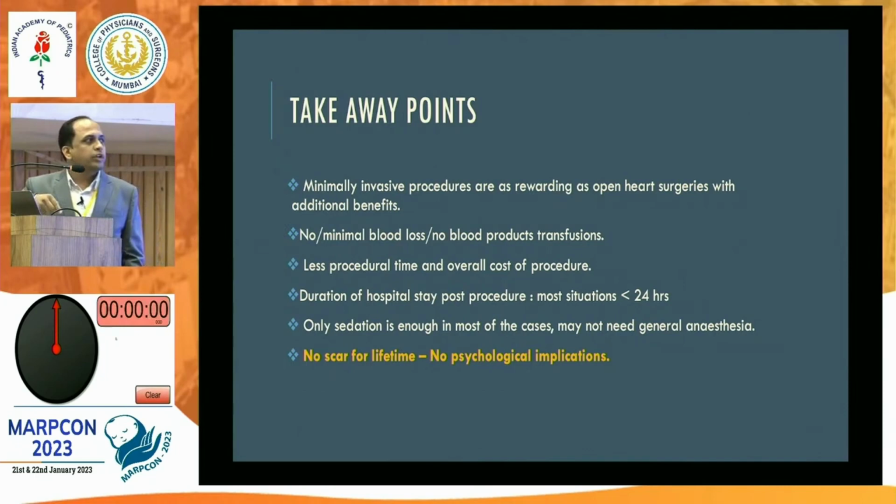Another most important thing is the overall cost of the procedure is much lesser than open heart surgery. And duration of stay, in most situations we are able to discharge the patient within the first 24 hours of procedure. So it is a very short time, like a daycare procedure. Another important thing is only sedation is enough in most of the cases. No need for general anesthesia. So far we have done 76 cases in Latur in the last 1 year, and all those cases we had done under sedation.